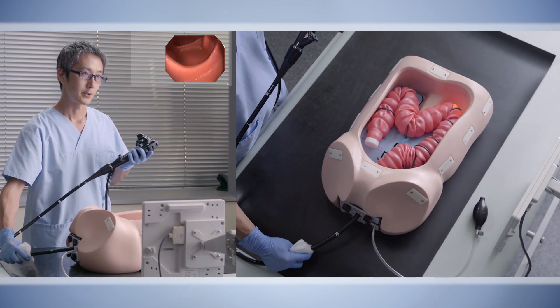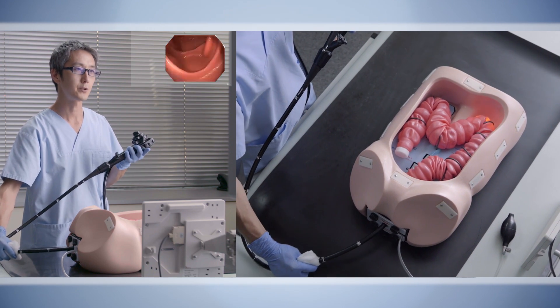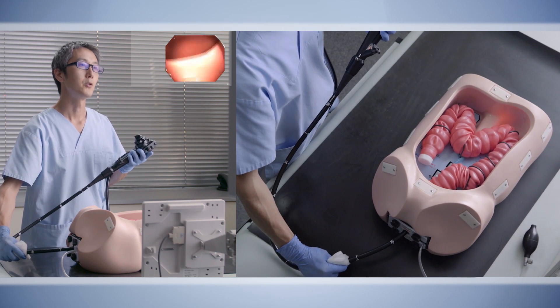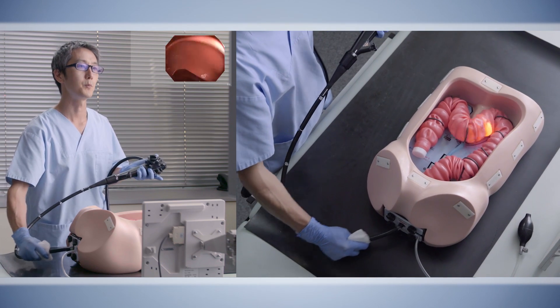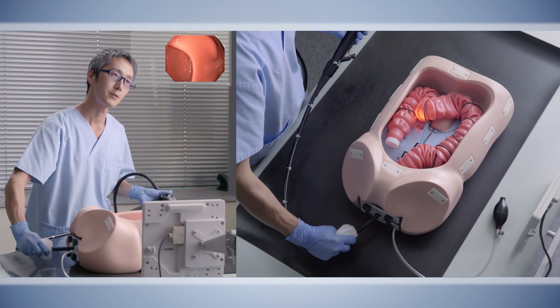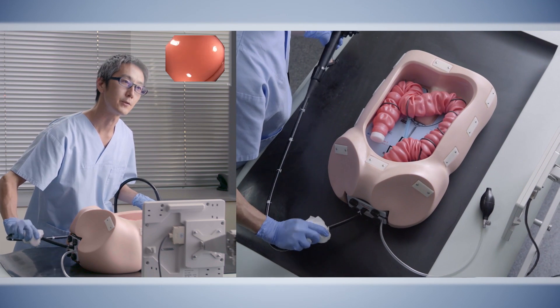The sigmoid colon might re-loop in this case, so we would always want to keep a sufficient right torque. At the splenic flexure, we perform a complete up-angulation and push the endoscope into the mid-transverse colon, where we start to centralize and shorten the transverse colon.